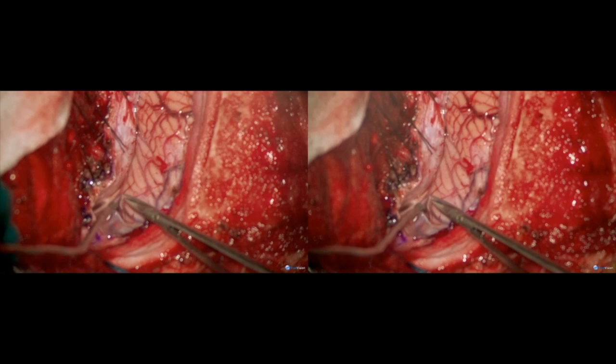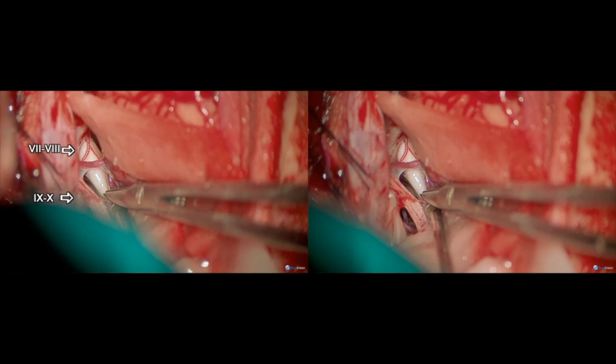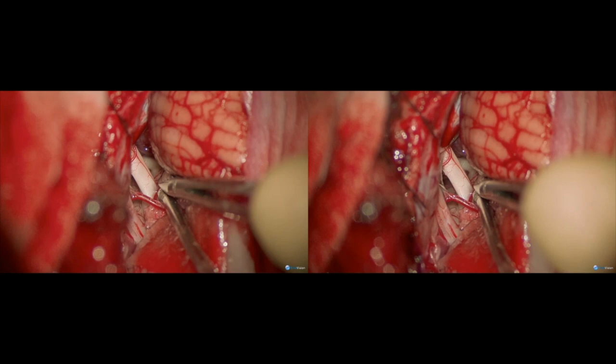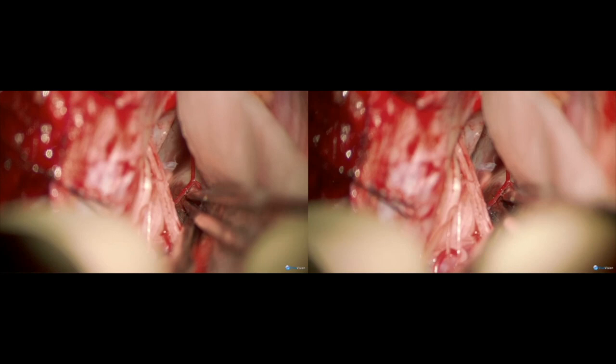We proceed with arachnoid dissection along the accessory nerve. We see the point of entry of the vertebral artery, and the 7-8 complex as well as the lower cranial nerves are dissected. Cranial nerve 5 is seen at the depth. Branches of the anterior inferior cerebellar artery are also dissected and preserved. Eventually the point where the hematoma comes to the surface is seen on the ventral pons, just above the pontomedullary fissure.